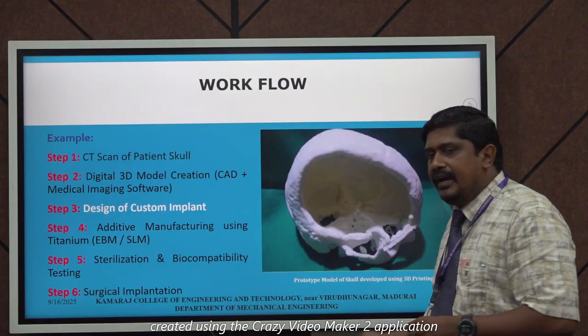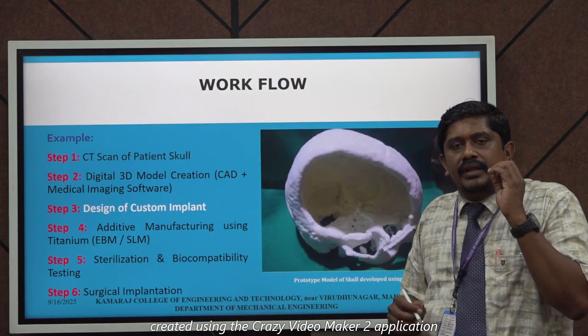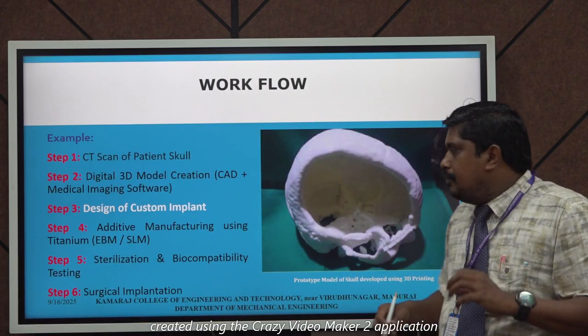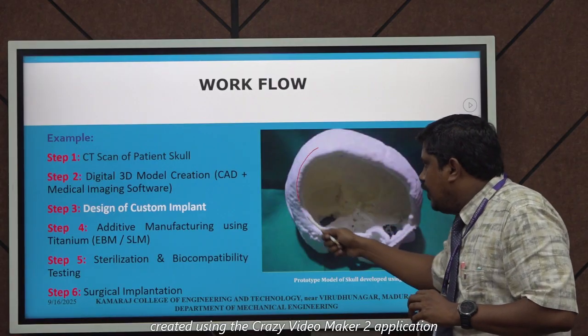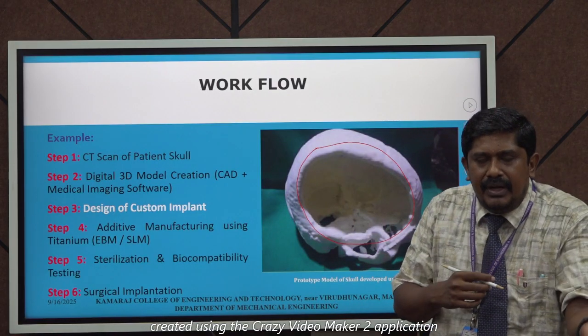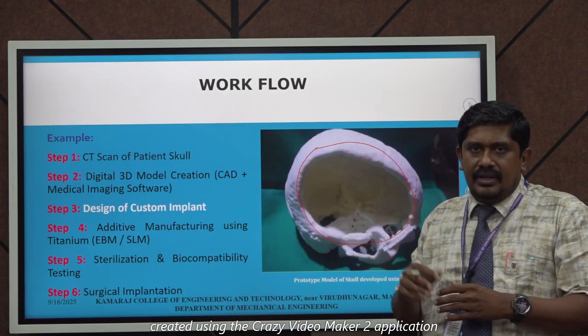This is actually a 3D printed PMMA material, a normal FDM printed part. By using this part, before implementing the real case, we made a trial surgery.